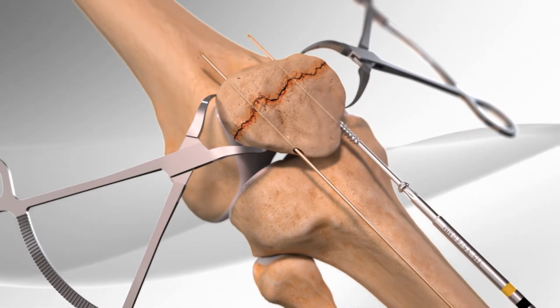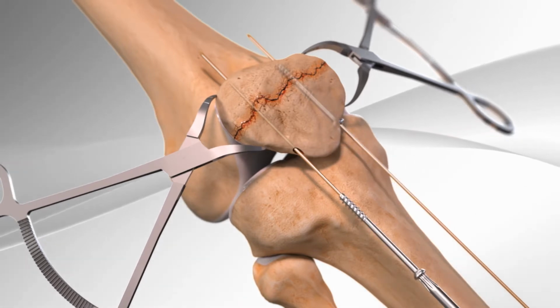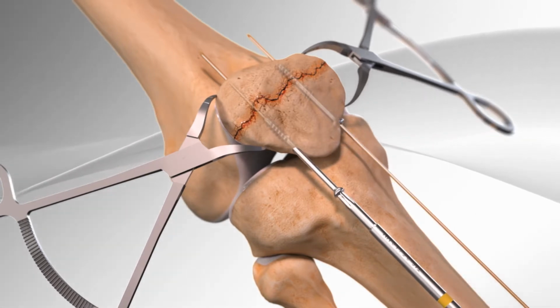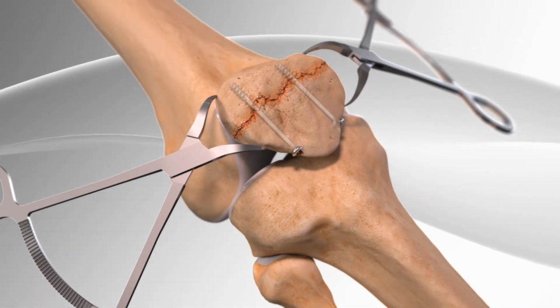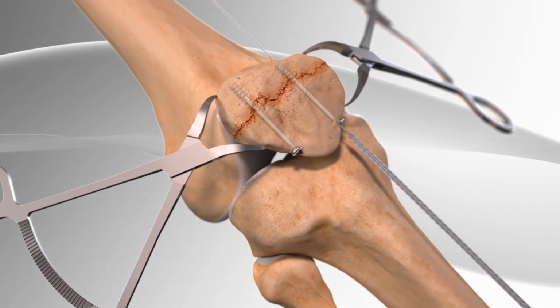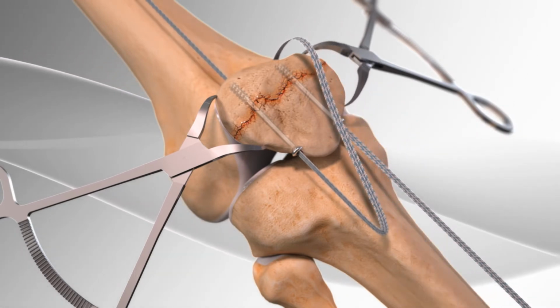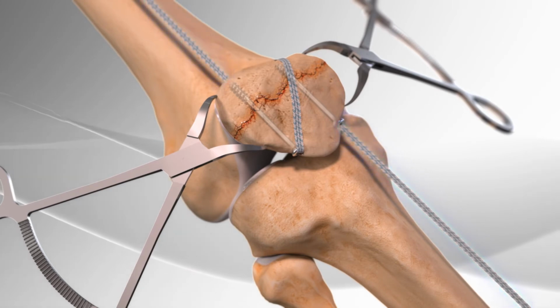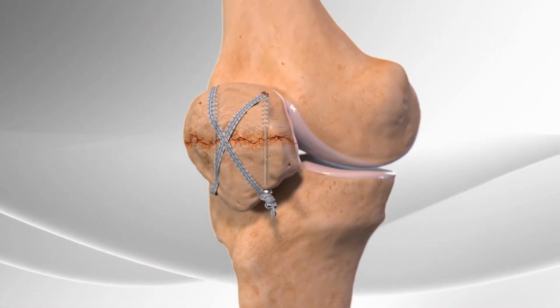Then, the correct screws are placed into the drilled holes. And sutures are placed through the screws to make a figure-8 pattern over the patella, holding the bone structure together. This completes the repair of the patella.